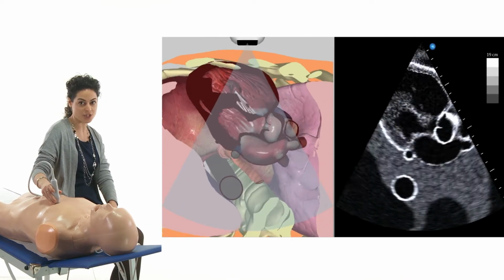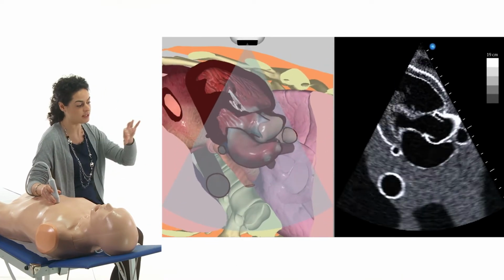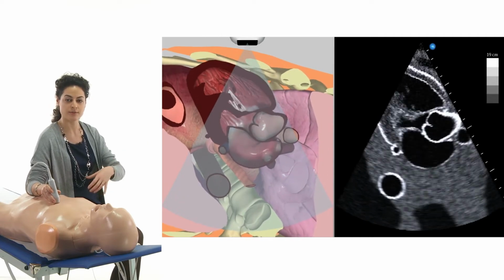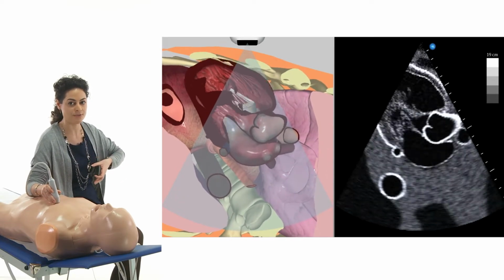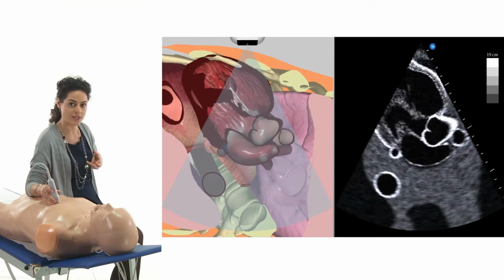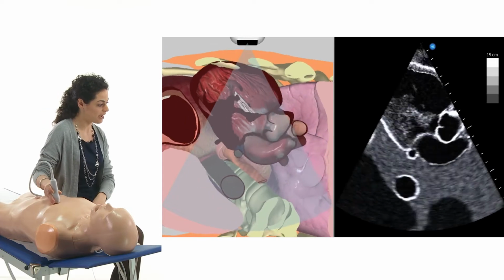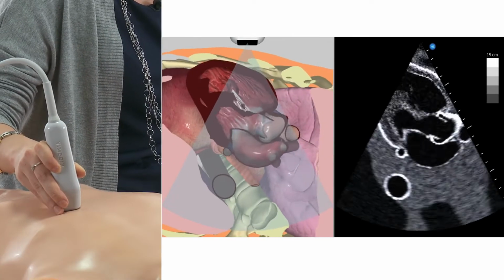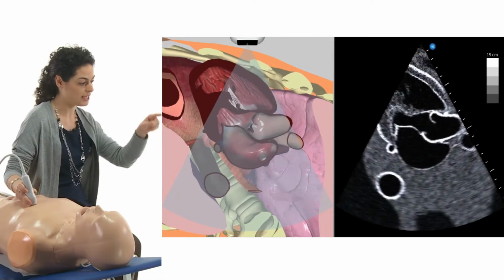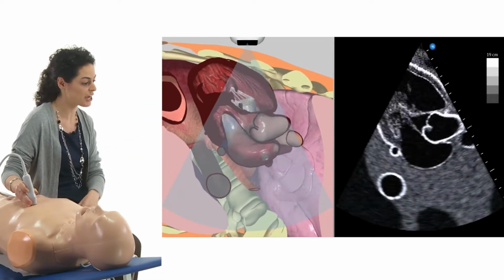Look, when we are imaging the heart from a parasternal long axis view, we can see the first part of the ascending aorta because the aorta goes from left to right, but the first portion comes anteriorly and then goes cranially. So actually, when you follow the anatomy, here we see the aortic root in the annulus, sinuses of Valsalva, and sinotubular junction.